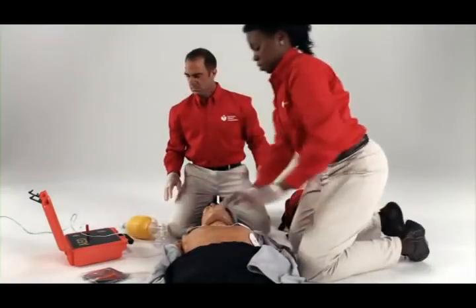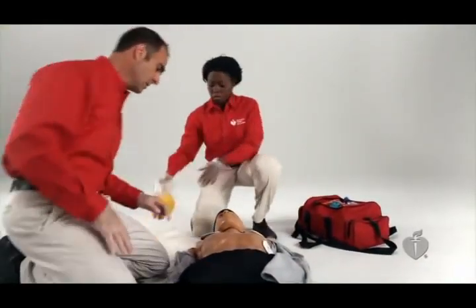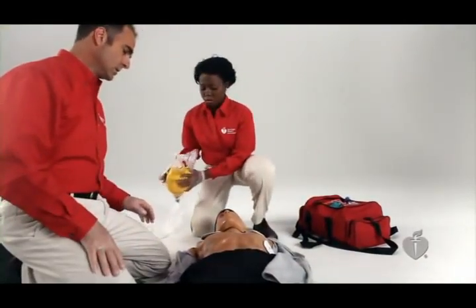11, 12. Analyzing heart rhythm. Do not touch the patient. Let's switch. Shock needed. Charging. Stay clear of patient. Press the flashing Shock button.